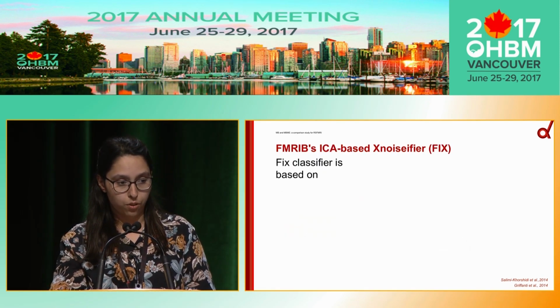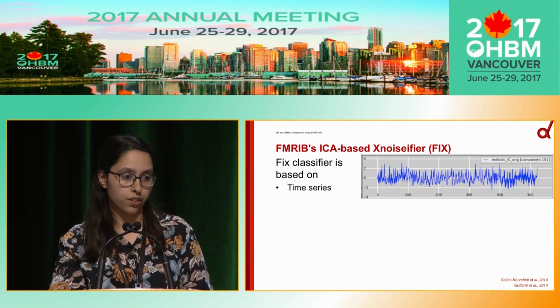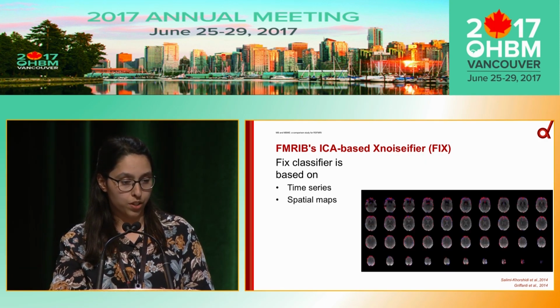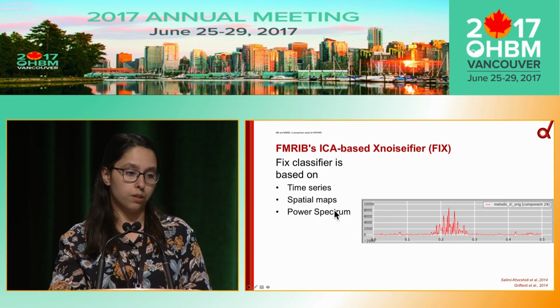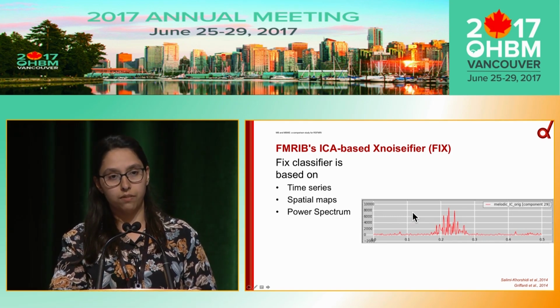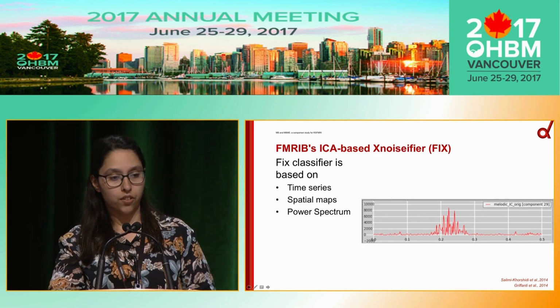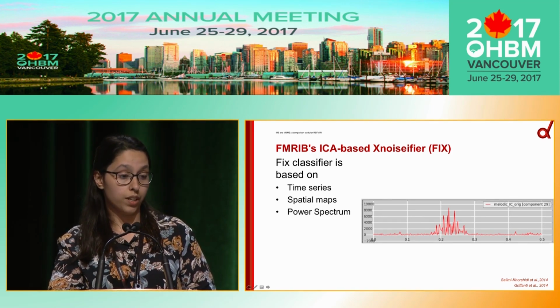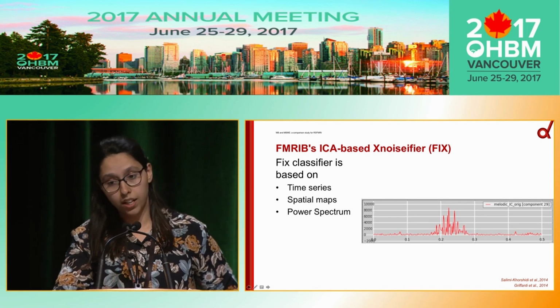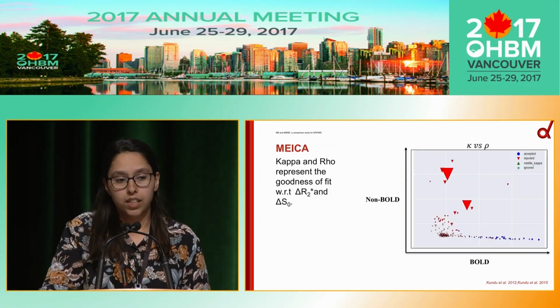So let's recap the FIX classifier. FIX depends upon training your own classifier, and the training depends upon the time series of the ICA components, the spatial maps, and finally the power spectrum. You look into these different features, and you try to classify them into categories of signal and noise. So we trained our own classifier. We acquired 10 subjects for multiband and multiband multi-echo.